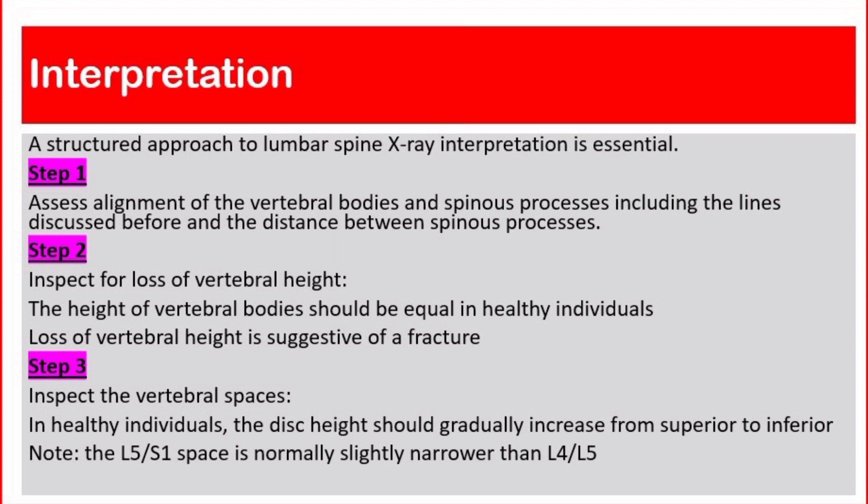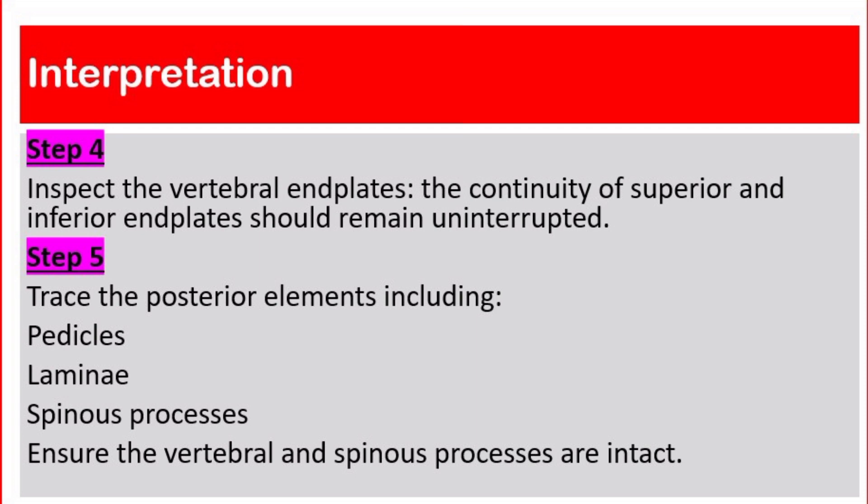Step 3: Inspect the vertebral spaces. In healthy individuals, the disc height should gradually increase from superior to inferior. Note that the L5-S1 space is normally slightly narrower than the L4-L5 space. Step 4: Inspect the vertebral end plates. The continuity of superior and inferior end plates should remain uninterrupted. Step 5: Trace the posterior elements, including pedicles, lamina, and spinous processes. Ensure the vertebral and spinous processes are intact.